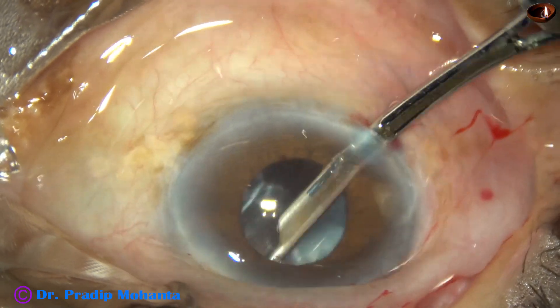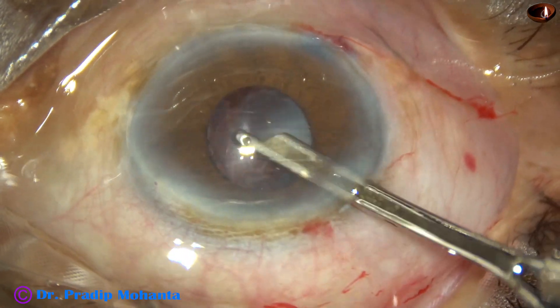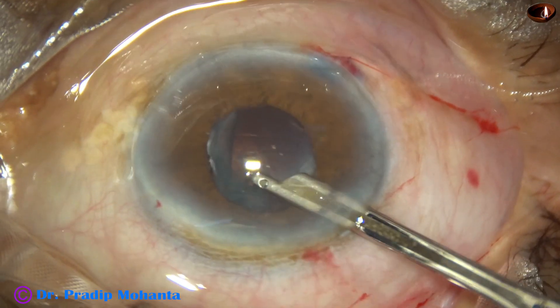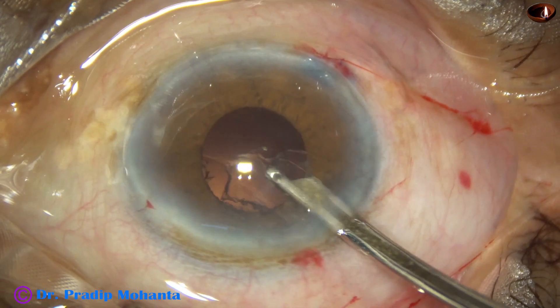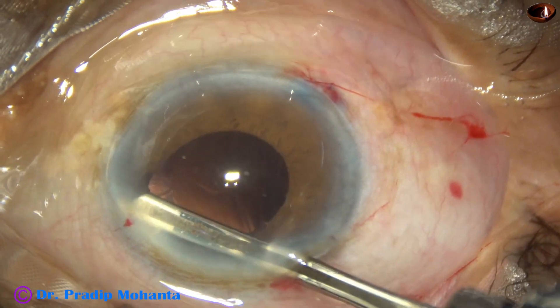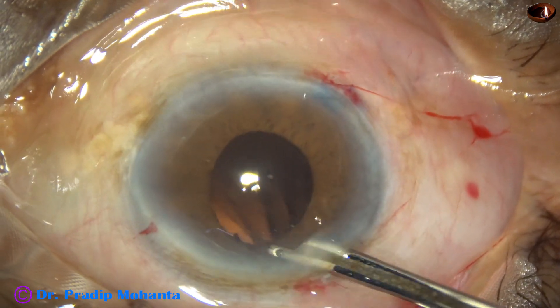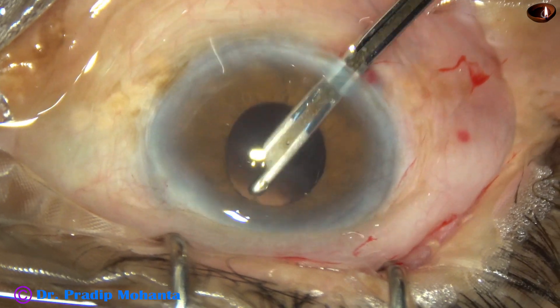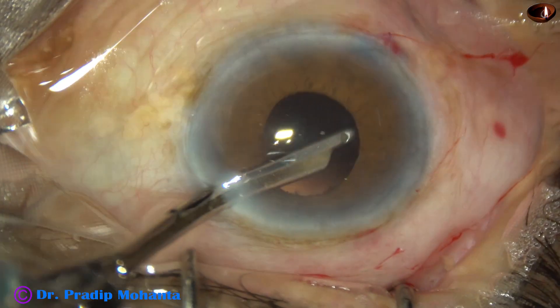And now this epinuclear material — I didn't try to remove this with the phaco handpiece. Simcoe is a safer choice since visibility is available for only a smaller area. I didn't try to remove this epinucleus with the phaco handpiece. Now I retract the iris and see where the cortex is. There is some cortex at around 12:30 o'clock that is removed. We can retract the iris to see where cortex remains and remove it.